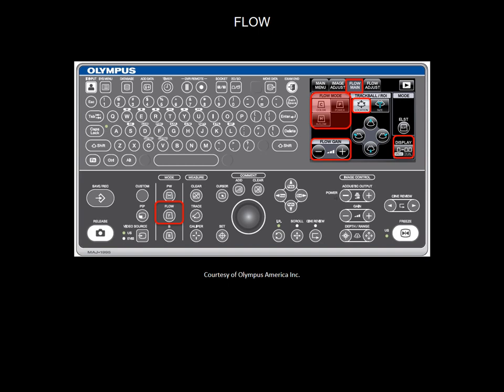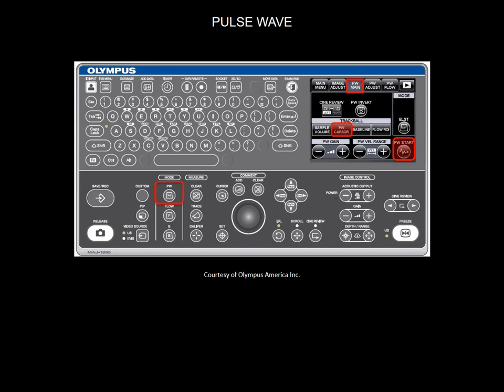BH flow or high-resolution flow mode is especially useful for imaging and for avoiding small vessels during tissue sampling. You can choose either the single flow mode display, or the dual display showing both the flow mode and the B mode.